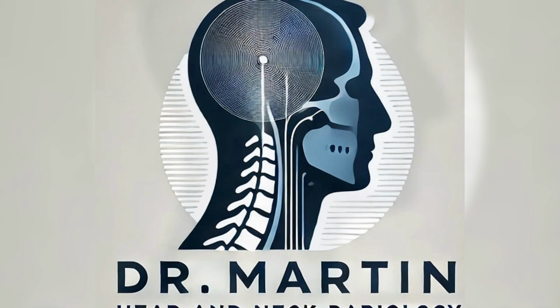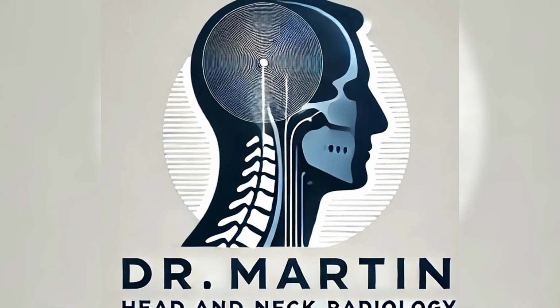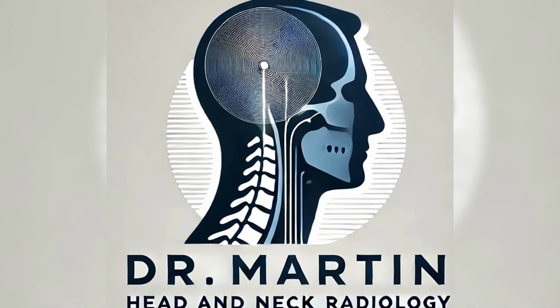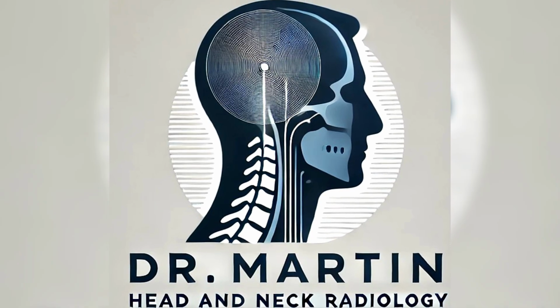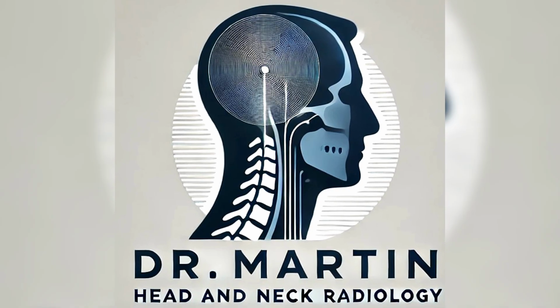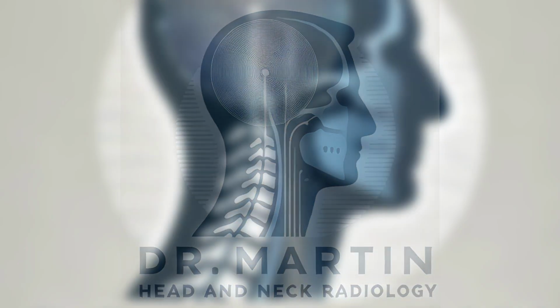In today's video, we will review the radiologic findings of thyroid-associated orbitopathy, also known as thyroid eye disease or Graves' orbitopathy. This condition is the most common cause of adult exophthalmos, and recognizing its key imaging features is essential for radiologists, residents, and all healthcare professionals involved in head and neck imaging.